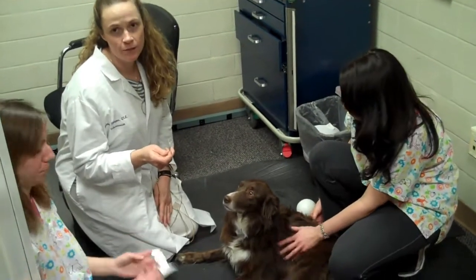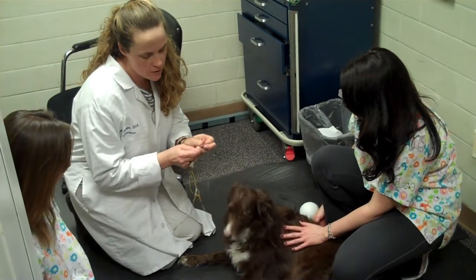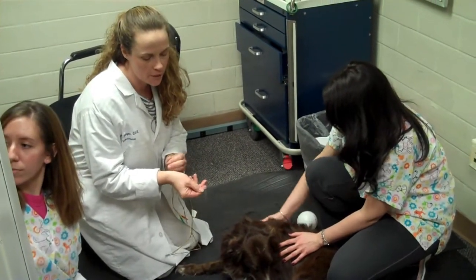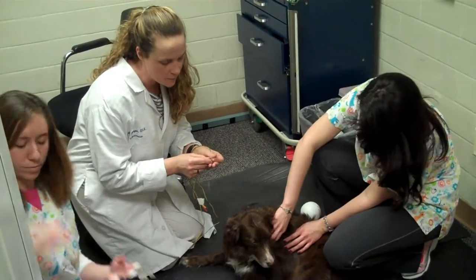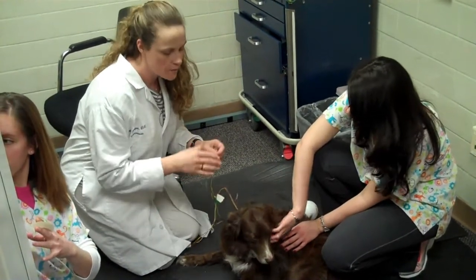Usually the scariest part for the owners are the needles — nobody likes needles, so I always show them. What we use to do the test is just a small needle that goes under the skin, it's called a subdermal needle. It's very small and very thin. Usually the biggest challenge of this test is that, because the needles are so small, if the dog moves a little bit, the needles can back out.